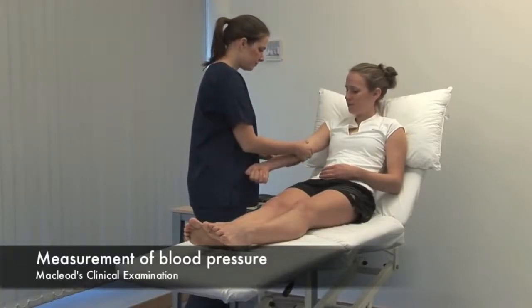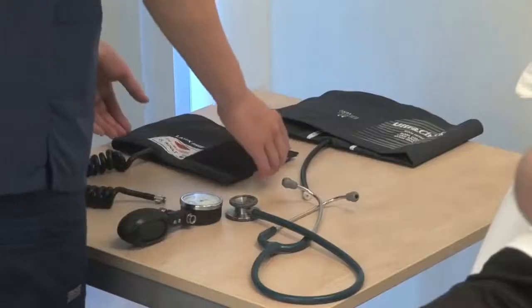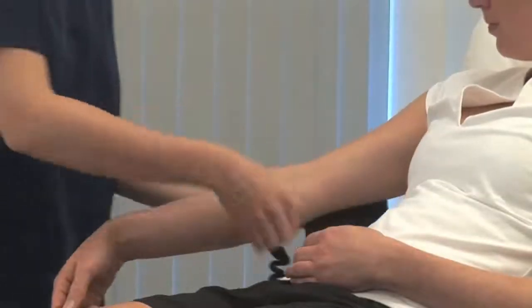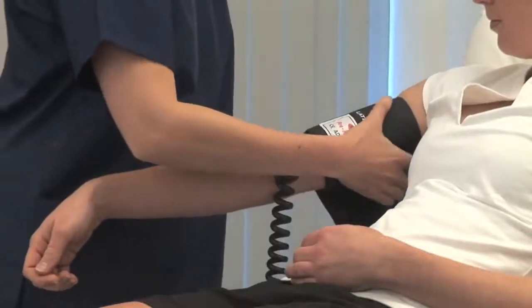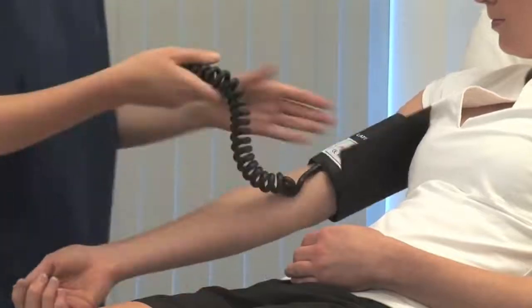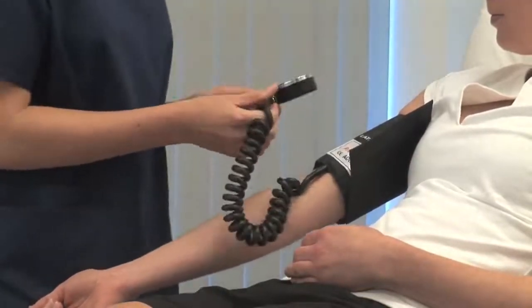The patient should be rested and seated or lying down. The arm should be comfortably supported at the level of the heart and free from constricting clothing. Choose a cuff of appropriate size and place the centre of the bladder over the brachial artery. Normally the right and left arm will give a similar result. Measuring over thin clothing should not affect the reading.